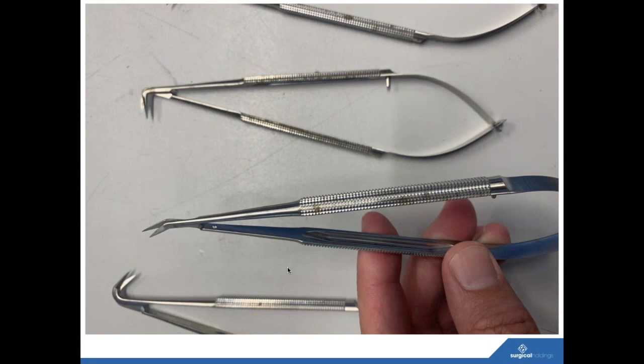And some of the devices, just because of how they're used, like this delicate scissor in the picture, have a really nicely finished grip, a serration that's just generally quite tricky. I wouldn't have said it had Bob not mentioned it, but it happens to have patterns on where the surgeon's been gripping it here. Bob, would you say? Oh, absolutely. Yeah, it's often overlooked and not cleaned, and it's pretty common to find on these types of instruments.